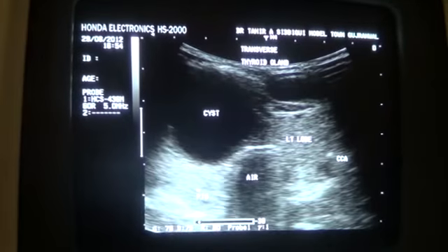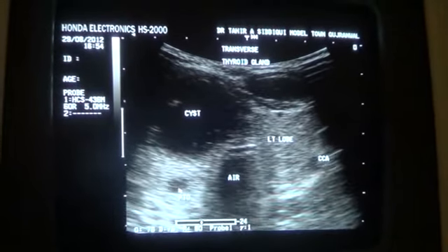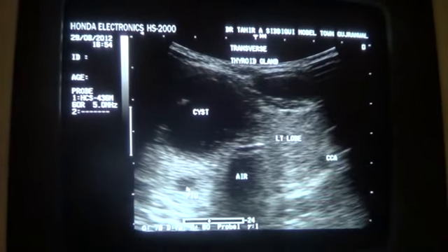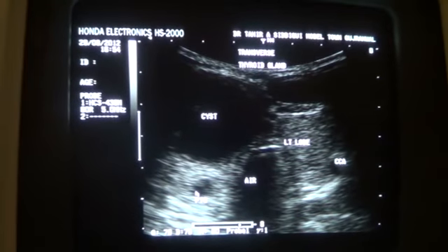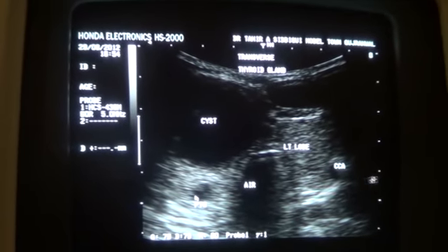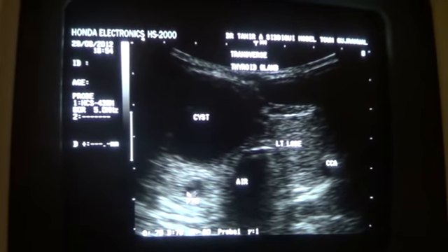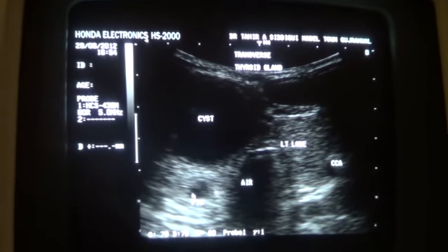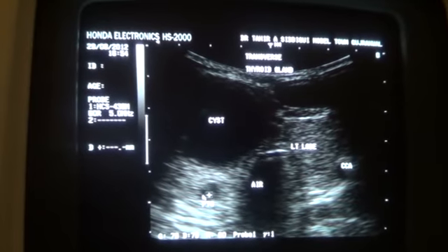This is not the common carotid artery, and this is the parathyroid gland that I initially said was the common carotid artery, because the common carotid artery will be lateral. This hypoechoic area, well demarcated with no posterior wall acoustic enhancement, is seen at the medial end. This is the parathyroid gland.